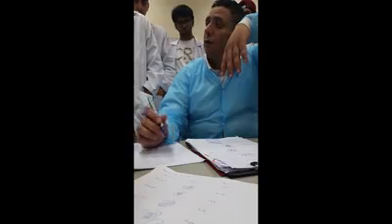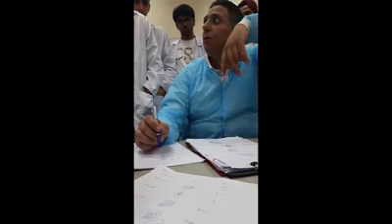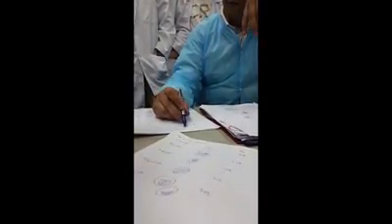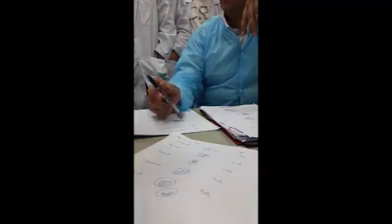So we will learn the technique of the types of white blood cell until we do the blood film. So the first step is to do the blood film, and afterwards we have to distinguish between them. Before we go into the blood film, I want to talk a bit about the white blood cell.